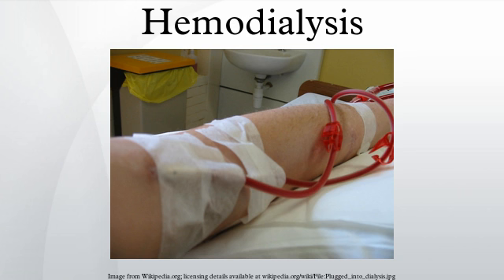Water system. An extensive water purification system is absolutely critical for hemodialysis. Since dialysis patients are exposed to vast quantities of water, which is mixed with dialysate concentrate to form the dialysate, even trace mineral contaminants or bacterial endotoxins can filter into the patient's blood.